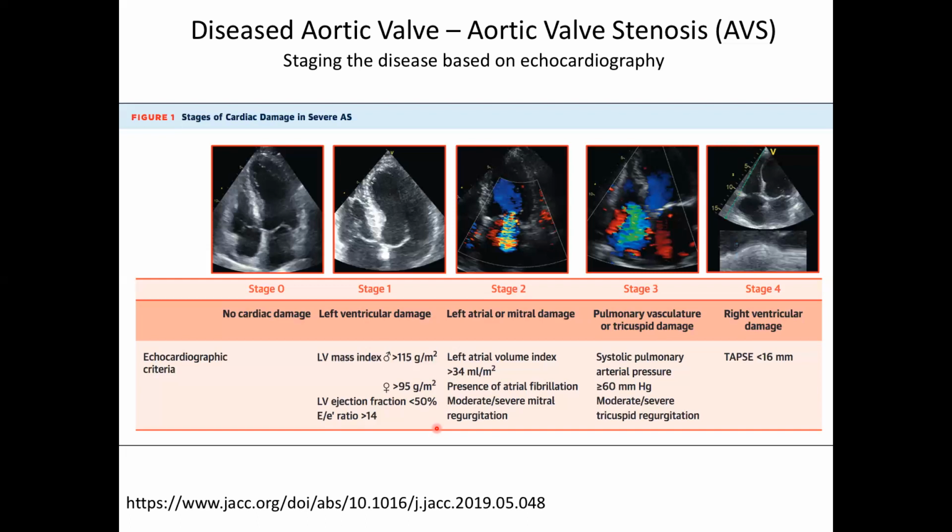So it's not a cottage industry, it's actually a real industry, and that is making these phantoms. If you go to any of these conferences, whether it's the echocardiography conference or the Radiological Society of North America or AHA or whatever, there will be booths there of people who make these phantoms. And usually you pay anywhere from 10 grand to 100 grand, depending on how complicated the phantom is.